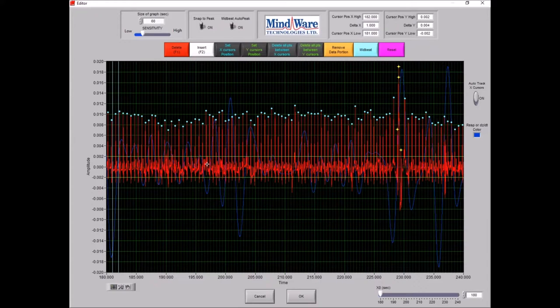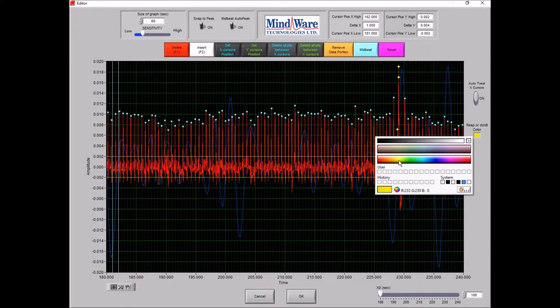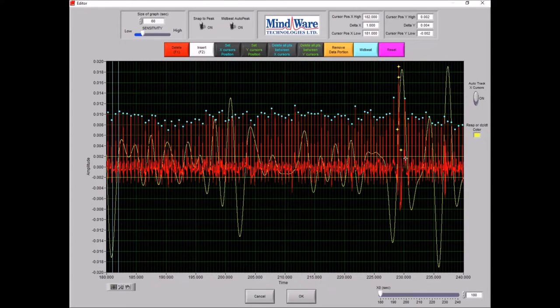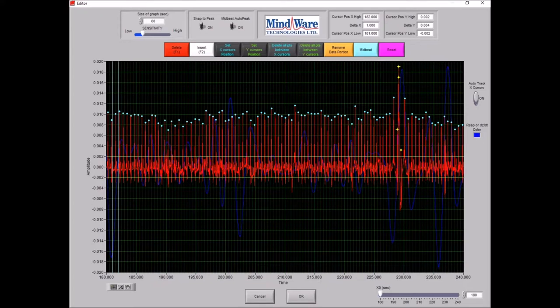This is the ECG editor where you'll perform all edits on the ECG data. The focal point is the plot where we see our ECG waveform and, in this case, respiration behind it. In impedance, you would see the DZDT waveform in blue behind the ECG. The respiration color can be changed by clicking the color box on the right-hand side — sometimes a distracting color, so we keep it darker by default, but you can change it to whatever you see fit.